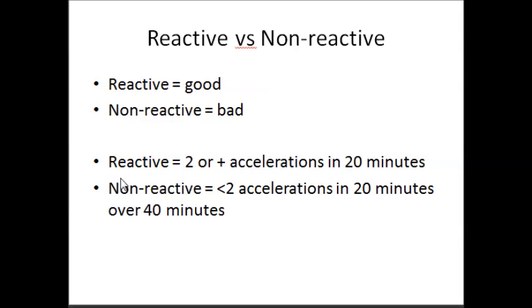Now if the non-stress test is reactive, that's good. You probably don't need to do much more monitoring unless there's indications for it. However, if the stress test is non-reactive, you may need to do some further testing just to make sure of the acid-base status of that child, make sure that child is developing normally.